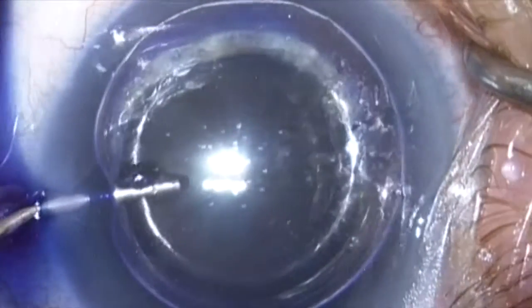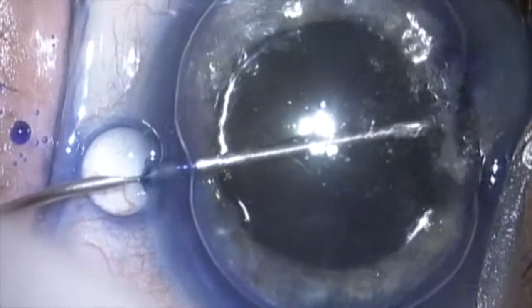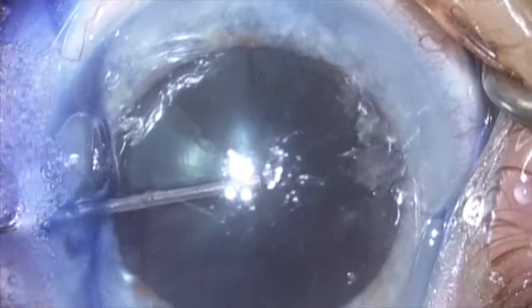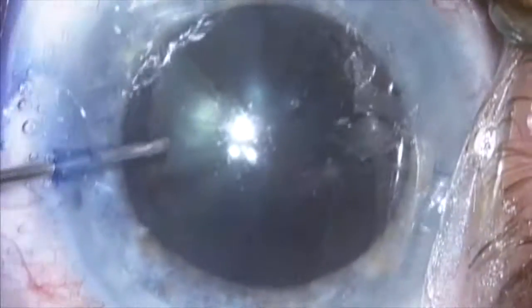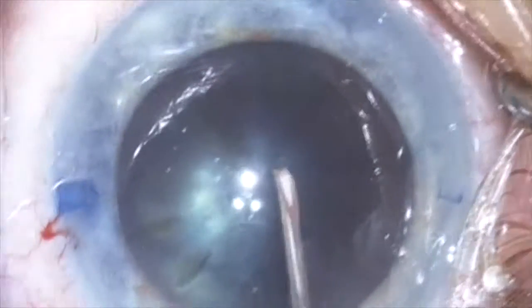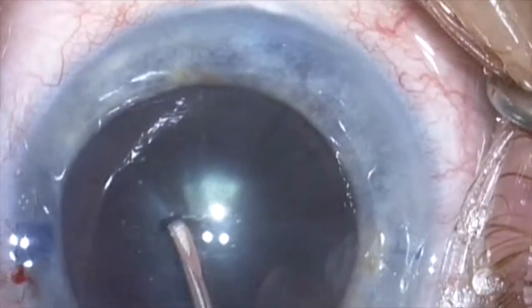Here we are using Vision Blue to stain the anterior capsule under air. This will be displaced with dispersive viscoelastic using a soft shell technique, and then cohesive viscoelastic is placed centrally.